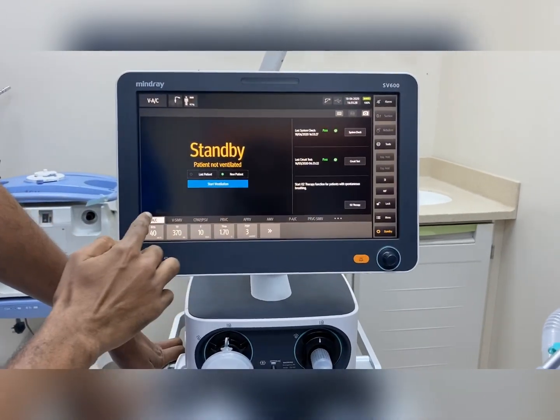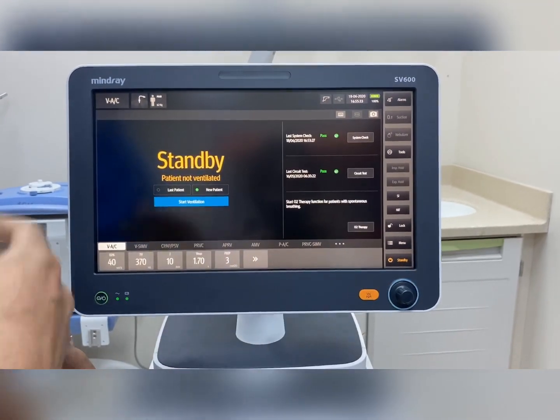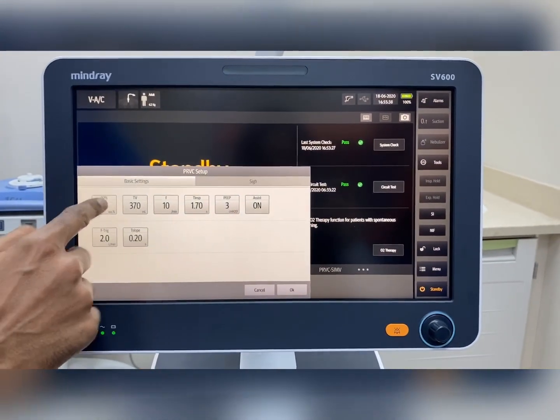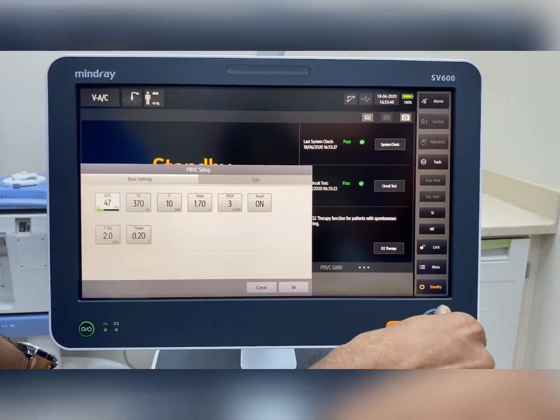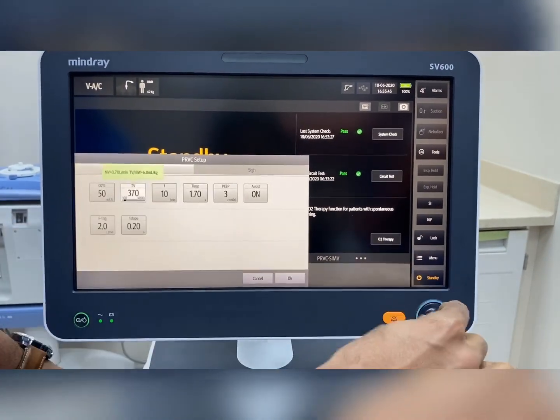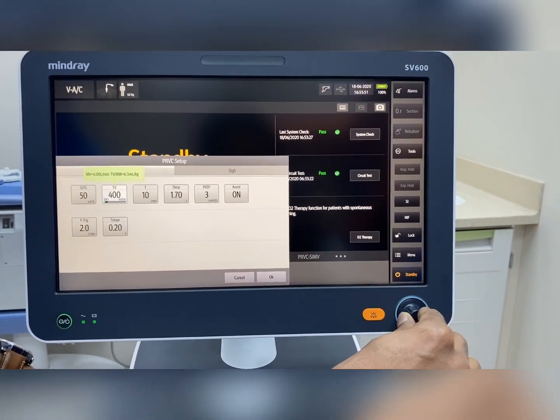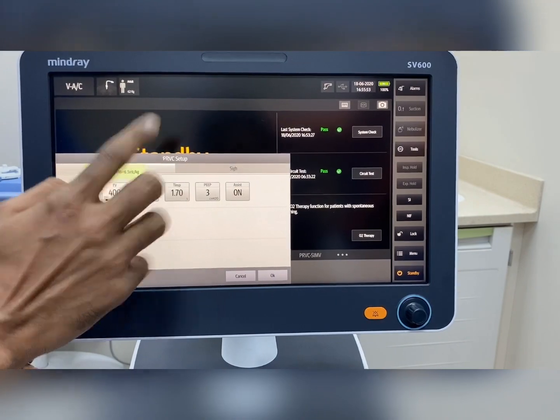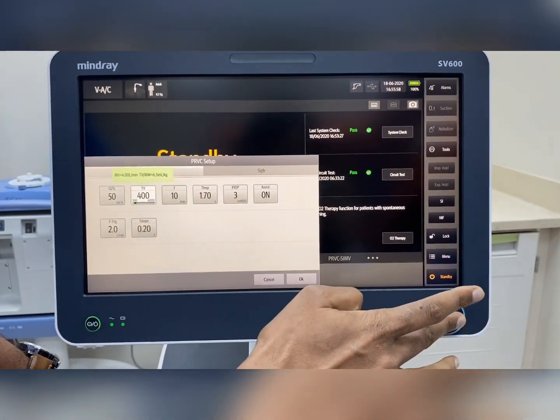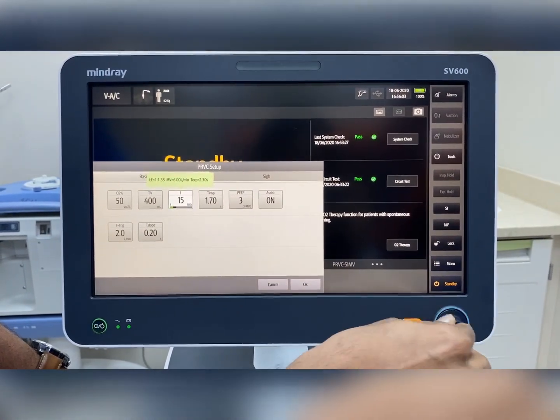Now we have to choose the mode. On the screen itself there are various mode options. The usual mode in the ICU is ACVC plus, which is PRVC. We can manipulate the settings simply by adjusting the knob. If you increase or decrease the tidal volume, you can see the ideal body weight, how many ml per kg is being delivered to the patient, and the total minute ventilation achieved. The rate can also be manipulated — all parameter adjustment is very simple.